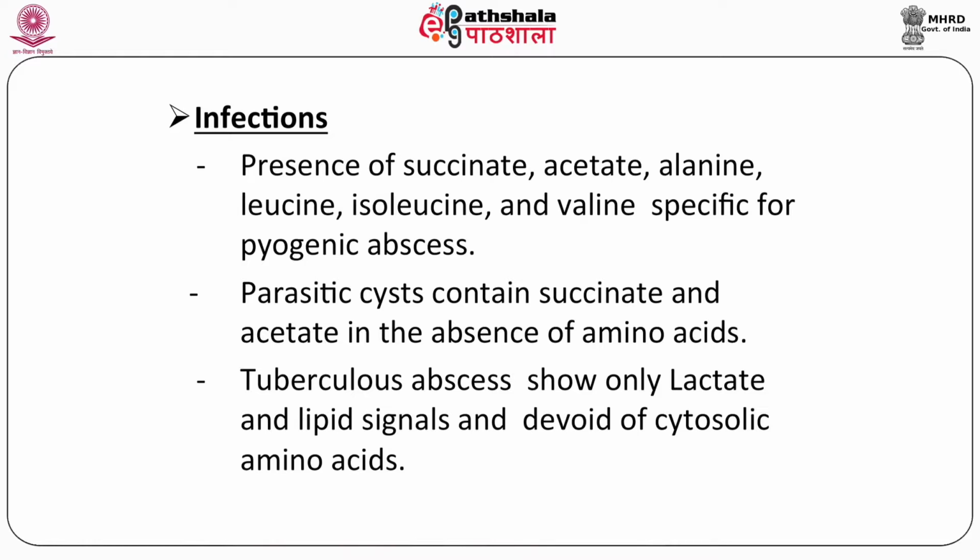Tuberculous abscesses also show only lactate and lipid signals and are devoid of cytosolic amino acids.